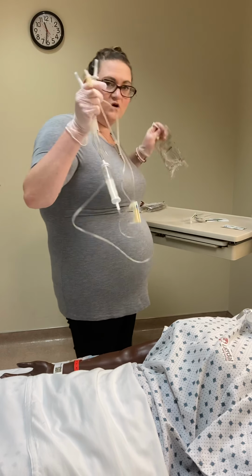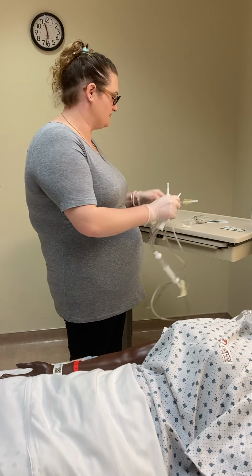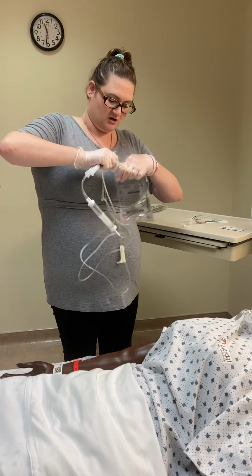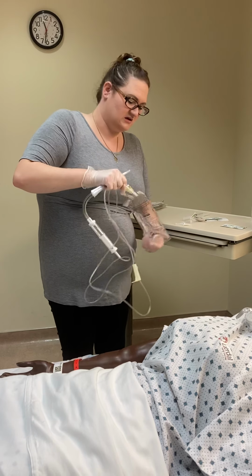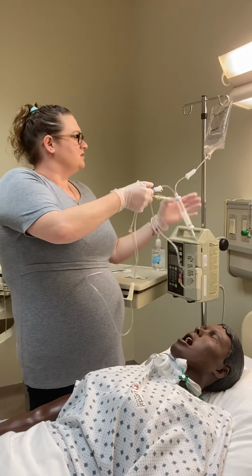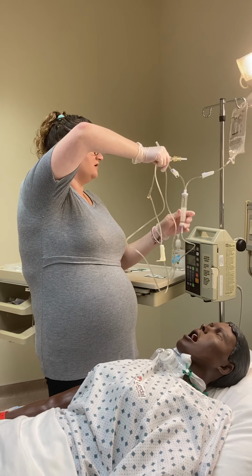So I'm gonna use one of these spikes to spike my bag. And again, if you had something in the MAR, you would scan her and scan the bag into the MAR. I have everything clamped. I'm going to hang that. I'm gonna undo my roller clamp for that.